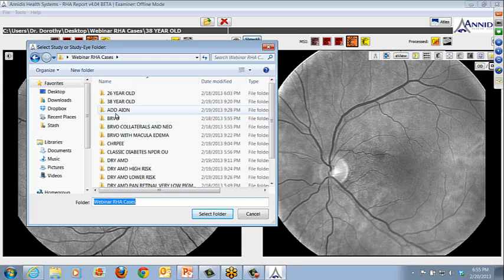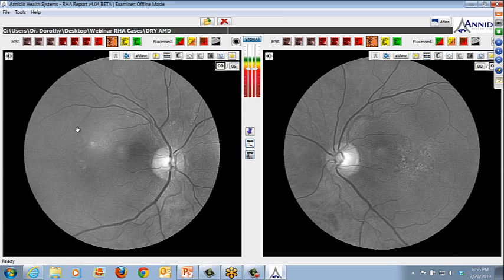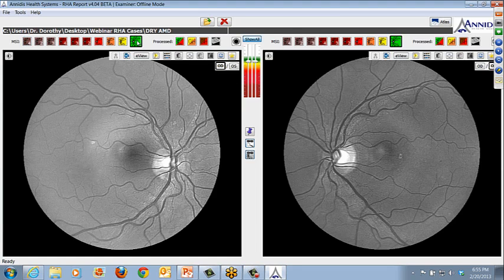All right. So I'm primarily going to talk about AMD, but because I've had so many questions about particular pathologies, I am going to go through some others. I'm going to concentrate on AMD for right now and just walk through some images that are not necessarily perfect and that may have subtle pathology and more overt pathology. So I'm just going to walk. I'll actually start anterior and go posterior in the retina.